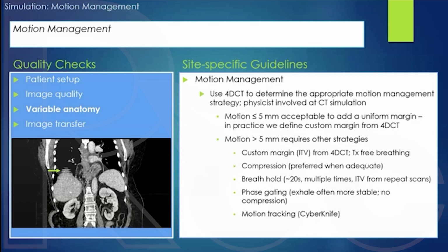And then the second question, which I've launched, that I actually intended to fall within this section of the talk, is related to motion management. Abdominal compression is what would absolutely result in the shortest treatment time, because the beam stays on while the patient is compressed.